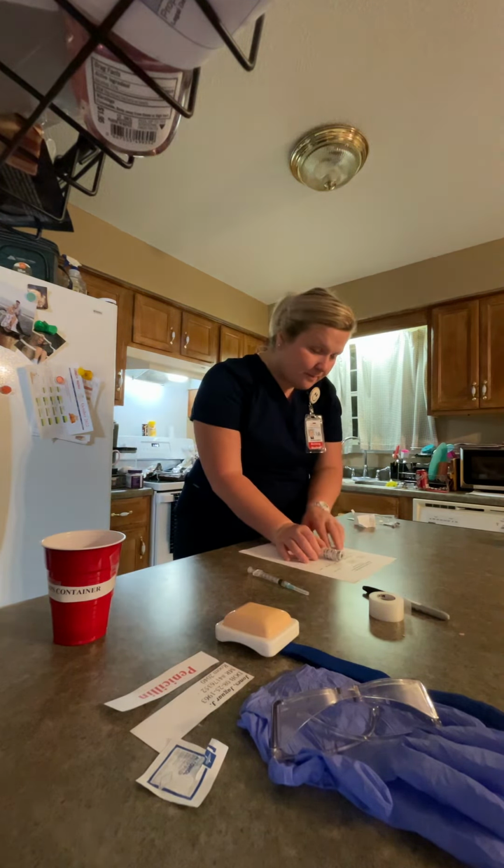As I said again, I would get another nurse to check over me just to make sure I did everything correctly. Now I'm going to make my label for my syringe.